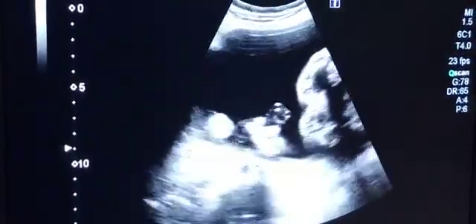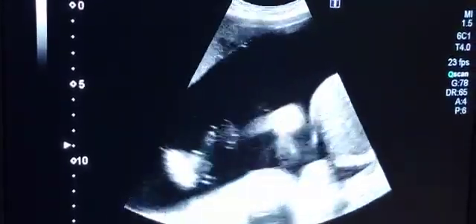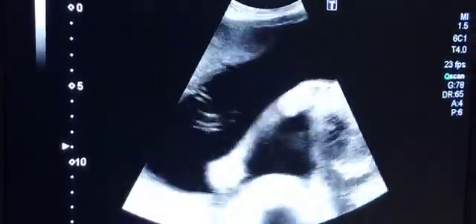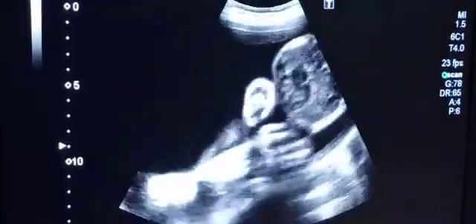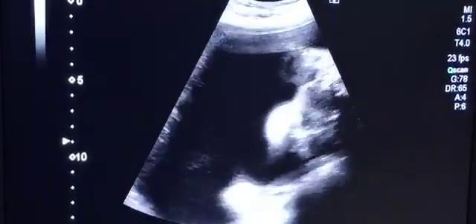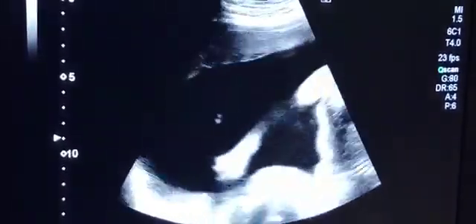We are performing an obstetrical scan on general survey. As you see, the liquor is markedly increased.